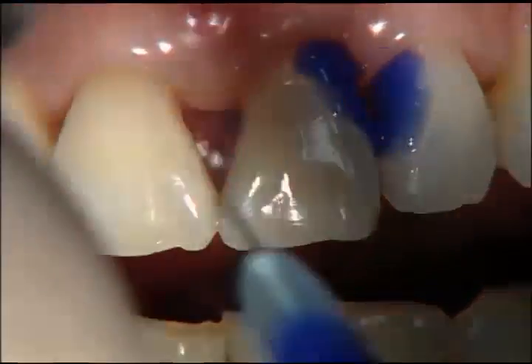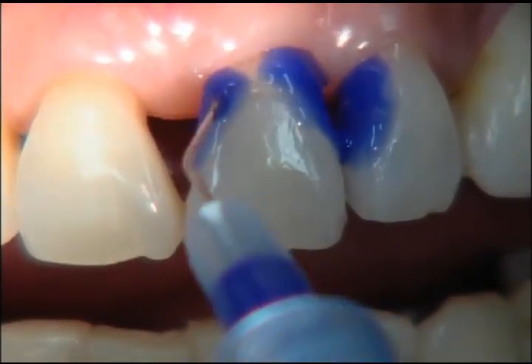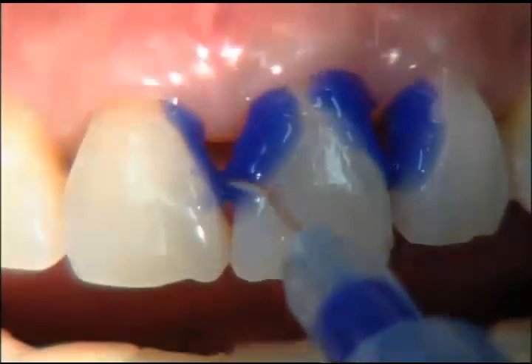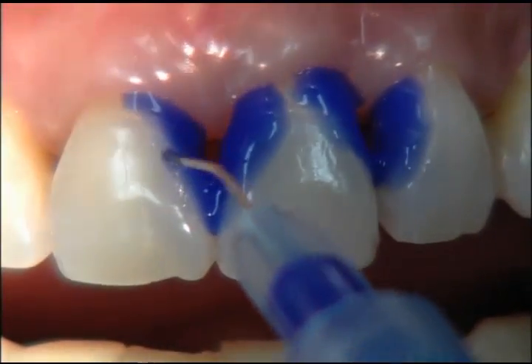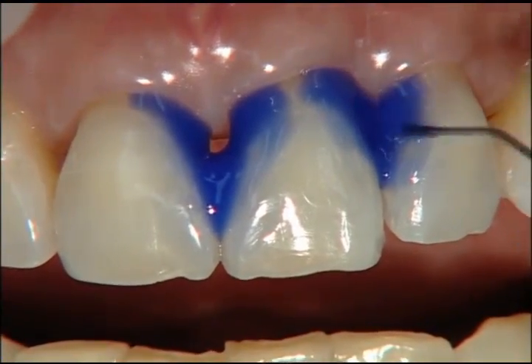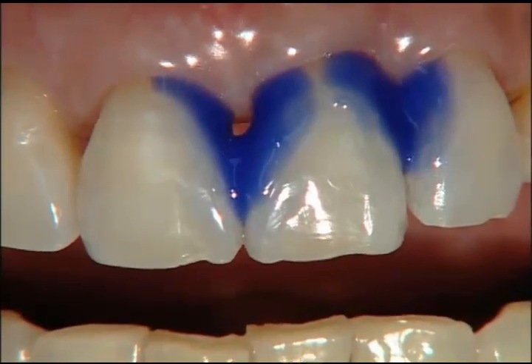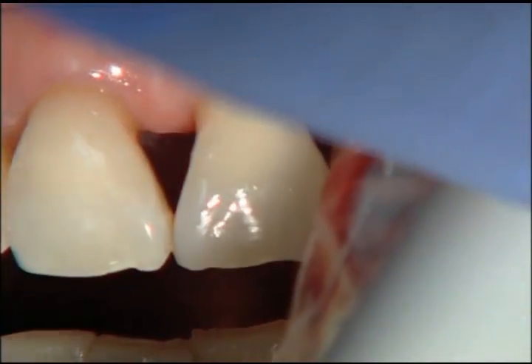We're not too concerned about getting the acid etch in contact with the gingival tissue because the tissue is so healthy. If this were a case where we were luting veneers that had been prepped and had temporaries on them, we'd be very careful not to get the etch on the gingiva because it could cause bleeding. So here we liberally apply it interproximally to these two teeth, just beyond where we expect the edge of the veneer to be, giving ourselves a little bit extra margin of error. Once we've rinsed all the etch off, we dry and place our first layer of bonding agent.